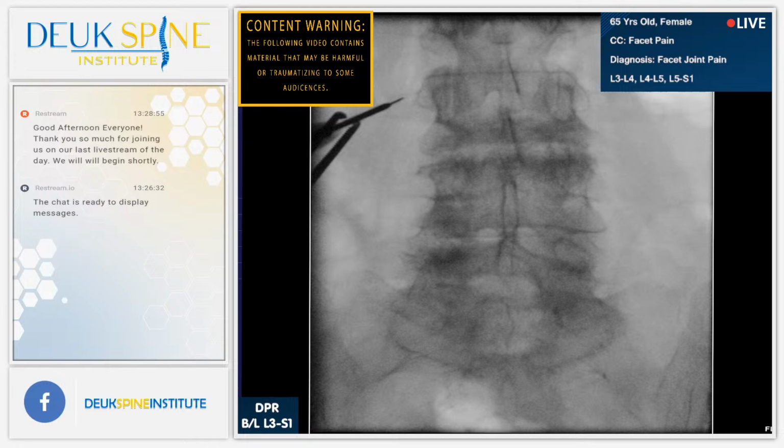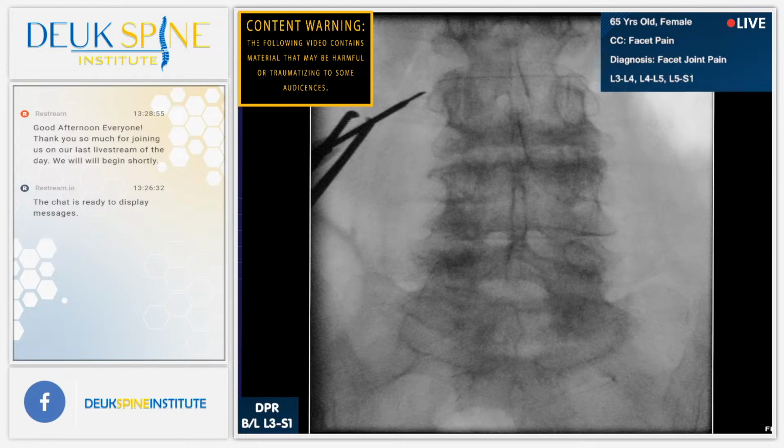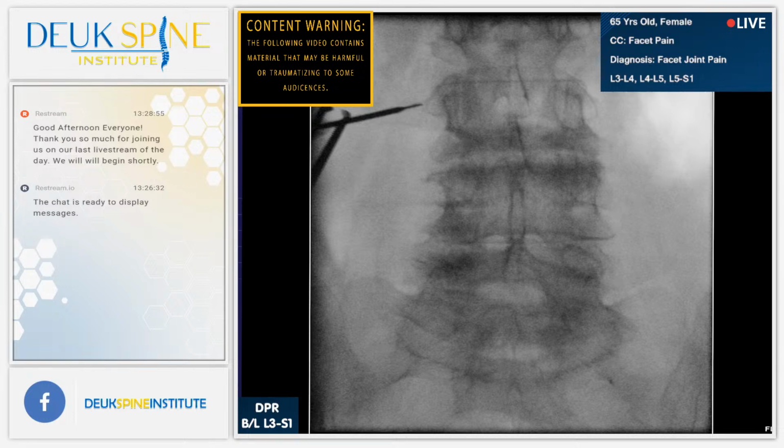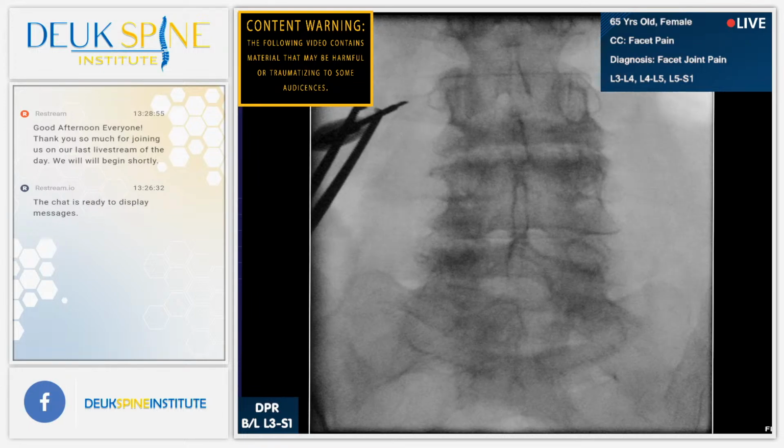All right, I think we got it. Pretty darn good. Yeah, that's really pretty good right there. Let me see, she's moving a little bit, so making it hard. She's moving things around. I just want to see if, yeah, that's perfect. If we get better muscle control with a little bit deeper, you know? That should be it. Okay, next we're going to move down to the L4 on her left side.